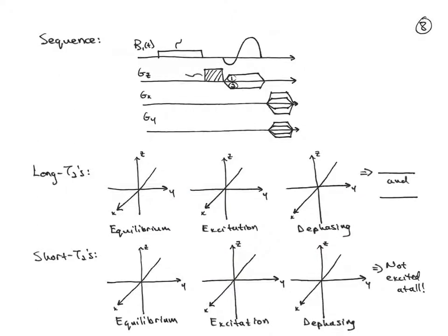Okay, so here's the pulse sequence. We have the pi/2 long, low amplitude 90 pulse. Then we have the crusher immediately following it. Then we do our half pulse sequence that I illustrated before. So what's happening here vector-wise?